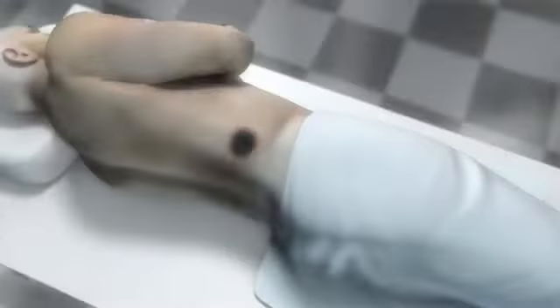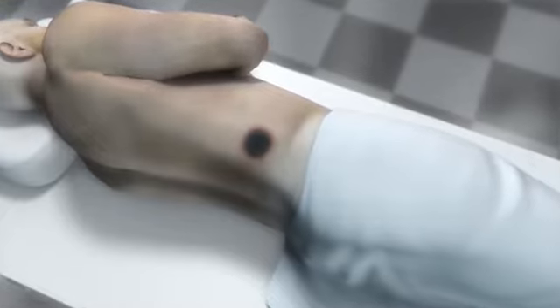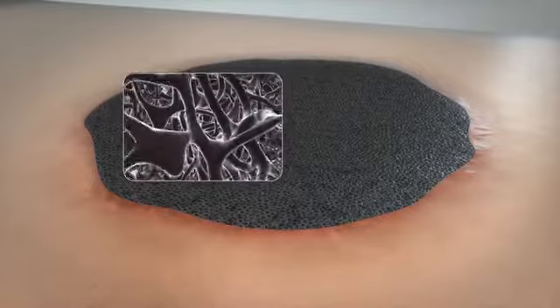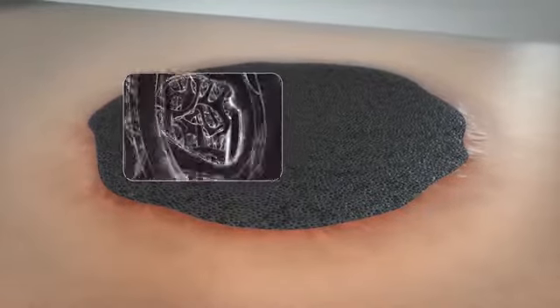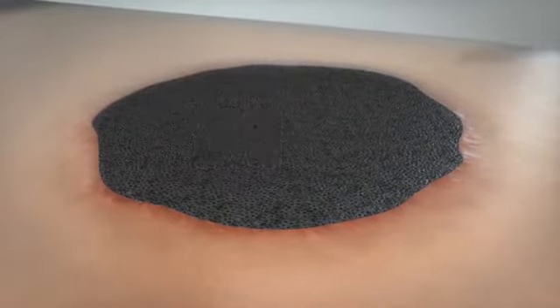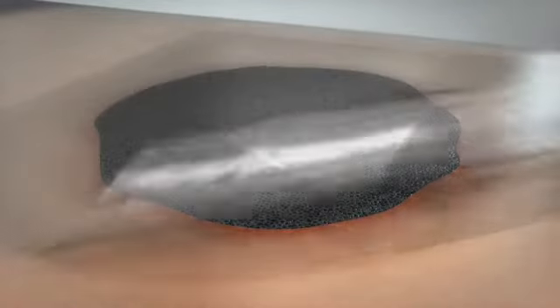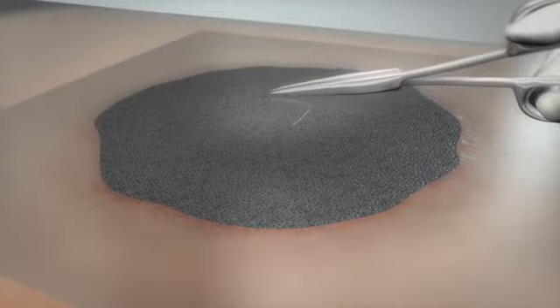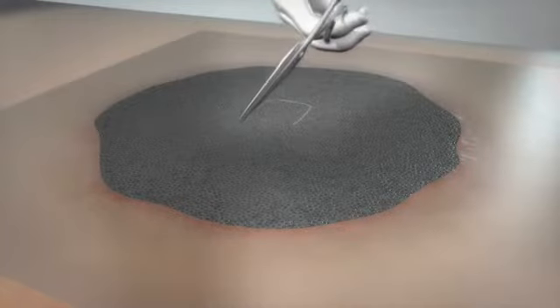When treating a wound using VAC therapy, the KCI proprietary GranuFoam dressing, which is a reticulated open cell foam, is placed directly into the wound bed. A semi-permeable drape is then used to seal the wound, provide a moist wound environment, and protect the wound from external contamination.